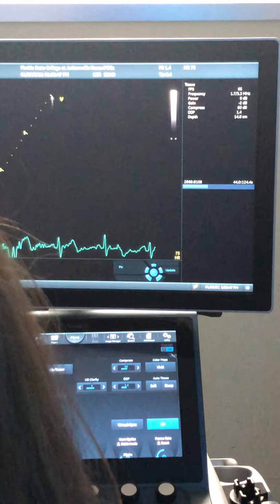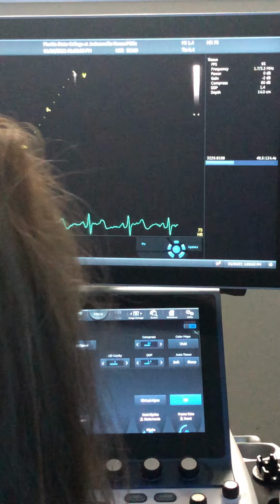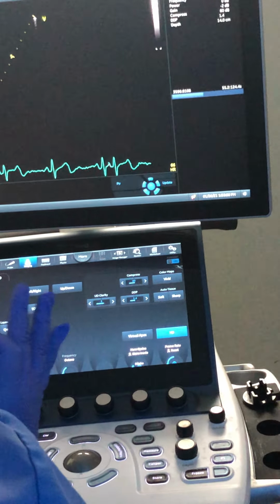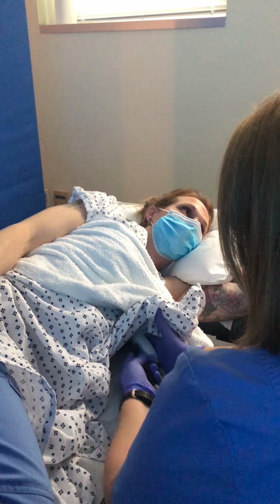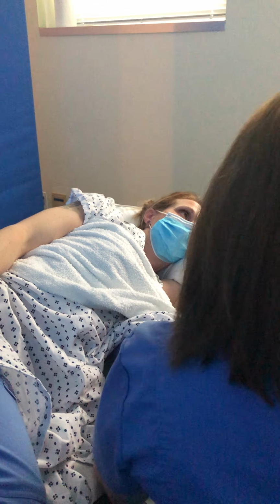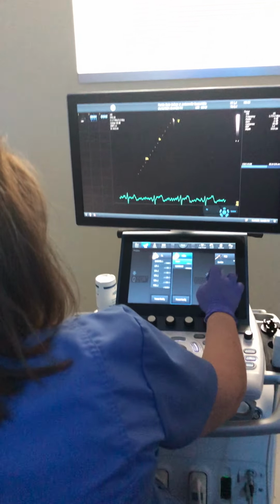This is just like a radar, where we've got to take this line and line it up with the aortic valve. Okay? So what I suggest you guys do, this is a good cheat, is when it's on 2D, I hold this right here, and I'll scan with my other hand. Okay, there's where my apical four-chamber is. And so I'm going to put this probe right where my apical four-chamber is. See how this is the flat part of the head? So I need to put that right where my apical four-chamber is. And then I'm going to switch this to my Pedof probe.